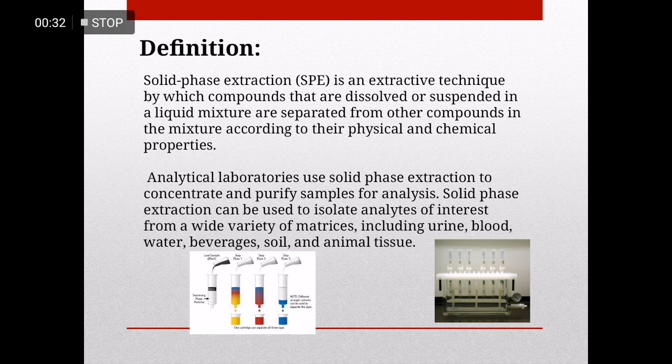In hospital labs, SPE is also used to separate a different compound from our body to perform certain tests to know certain types of disease in our body.